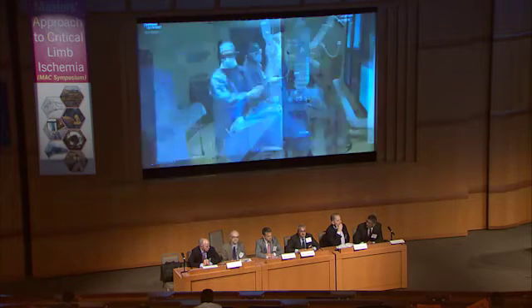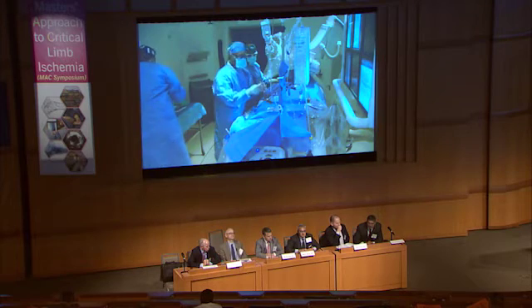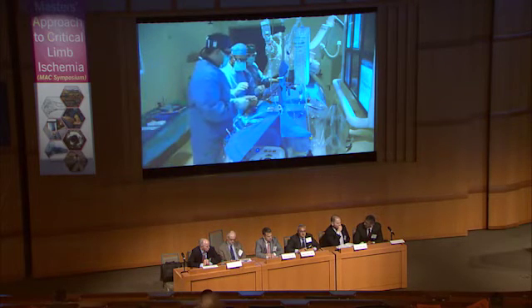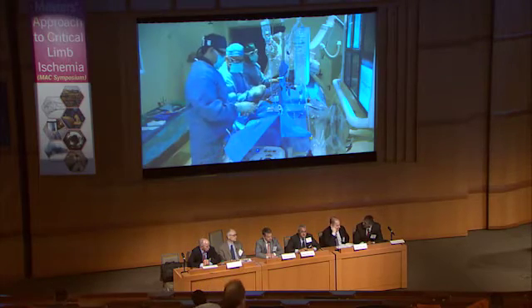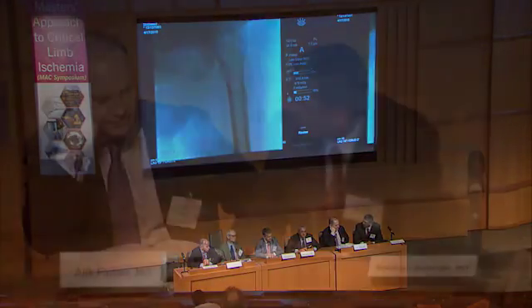I also want to raise, while we are discussing this and Mehdi is proceeding, that embolization of these AVMs is not an easy task, because as you keep coiling, sometimes you see newer areas of communications open up. So it is not a very simple thing to keep coiling communications of the vein from the profunda. It is a highly difficult task, and I think imaging would be a very limiting issue as we continue down this path. But I think this picture is going to be very revealing, Mehdi, and we are all awaiting it anxiously. Yeah, do it. Take it. Come back down.